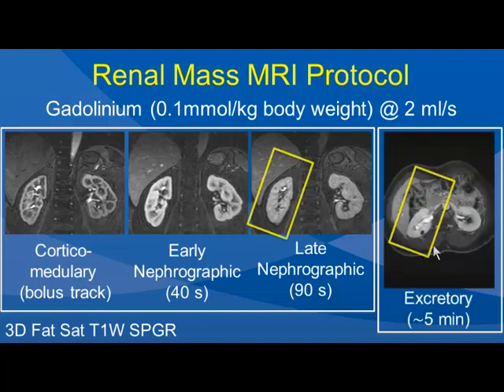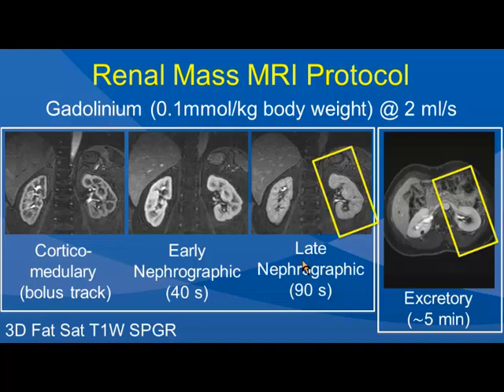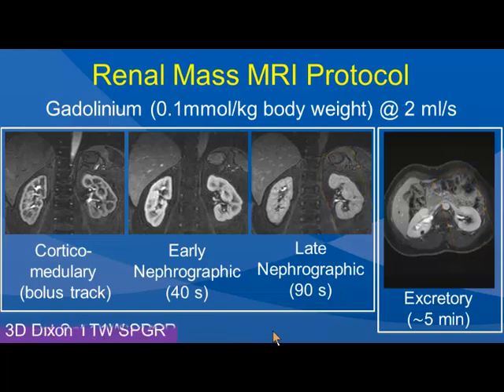The sagittal images are acquired, as I can show you here in this diagram, slicing the kidney longitudinally, independently in two different acquisitions, and those are very useful to look at the anatomy. We have moved away from standard T1 SPGR sequences. We now use Dixon-based techniques for all our dynamic images. They provide more homogeneous fat suppression routinely for these exams.